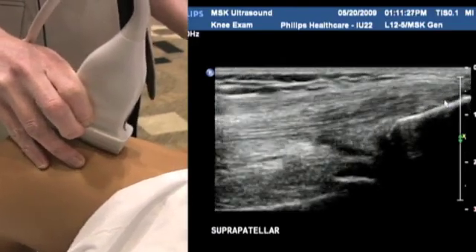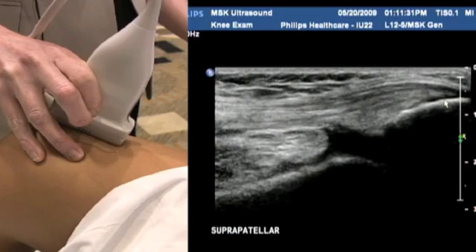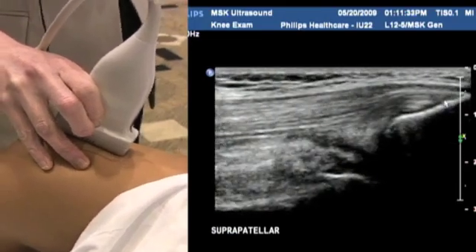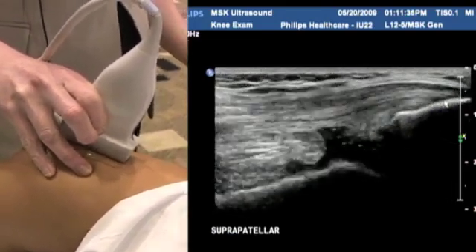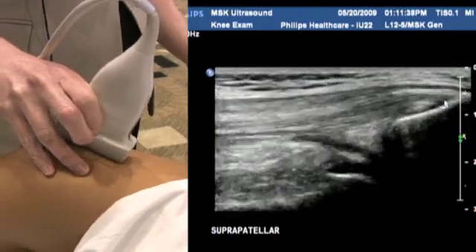And we can scan through medially to laterally, making sure we cover the entire tendon. It is quite a thick tendon, quite a wide tendon side to side. So like all ultrasound, you need to make sure you cover the entire area and sweep back and forth.